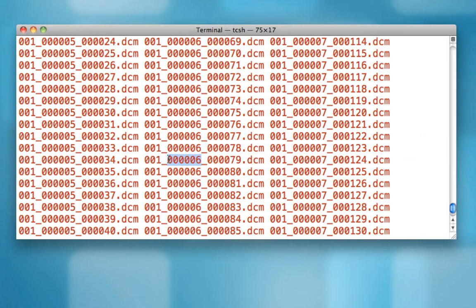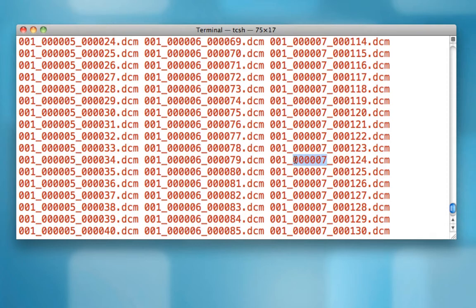These are indexed by this middle column right here. So this is run number six. For example, this is run number five. This is run number seven. Now in this experiment, the first four runs were setup runs, and then we had two functional runs, which are five and six, and then an anatomical scan, which is run number seven.